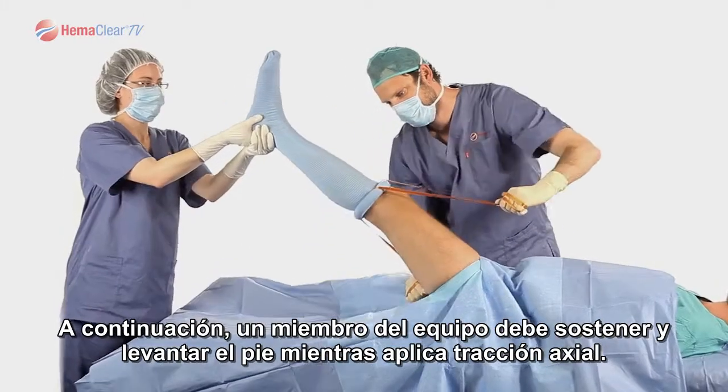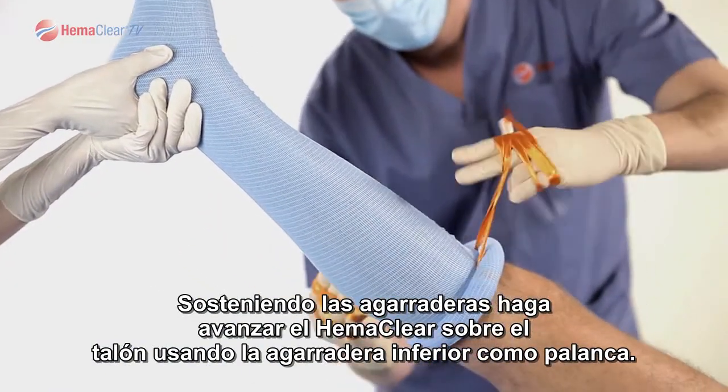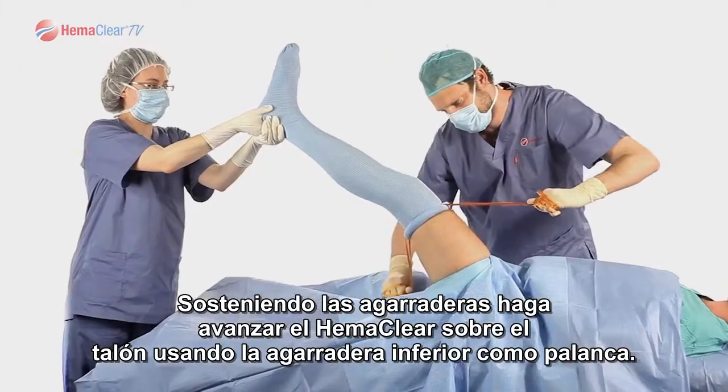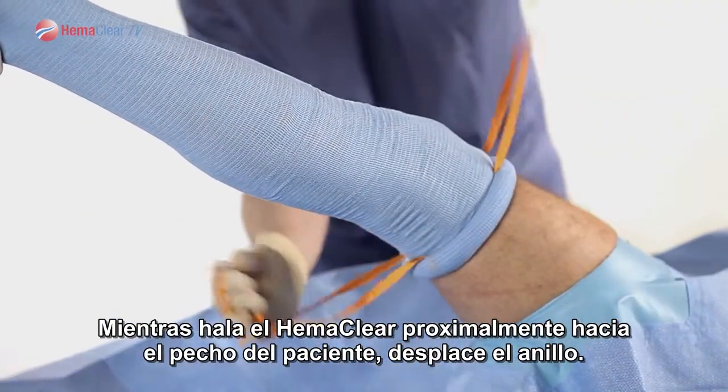Next, have one of your team members grab and raise the foot while applying axial traction. Grabbing the handles, advance HemaClear over the heel using the bottom handle as leverage. While pulling HemaClear proximally towards the chest of the patient, advance the ring.